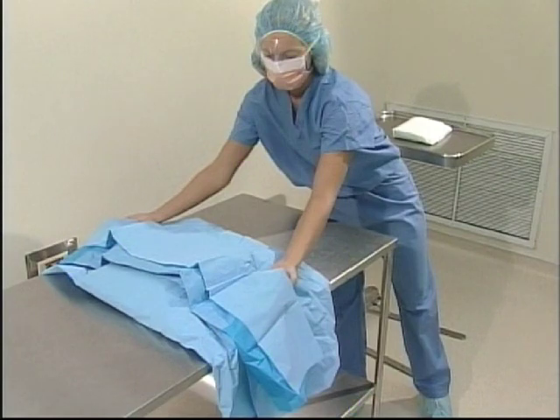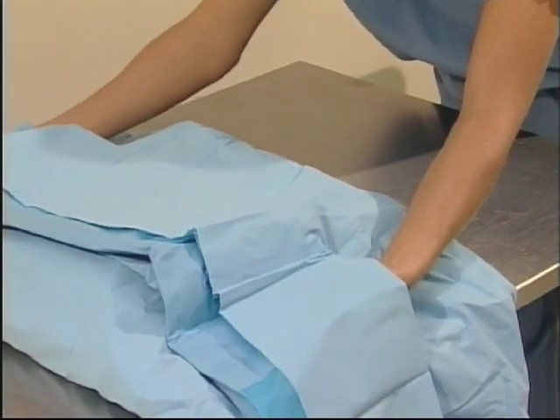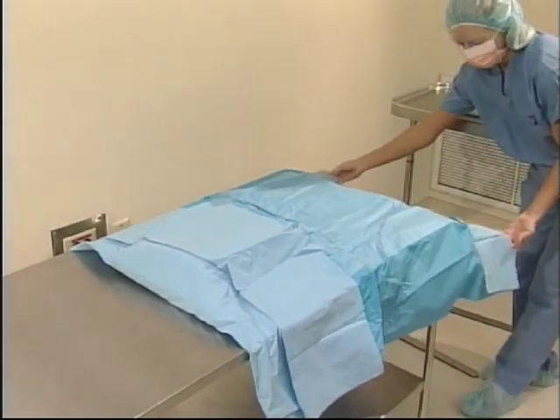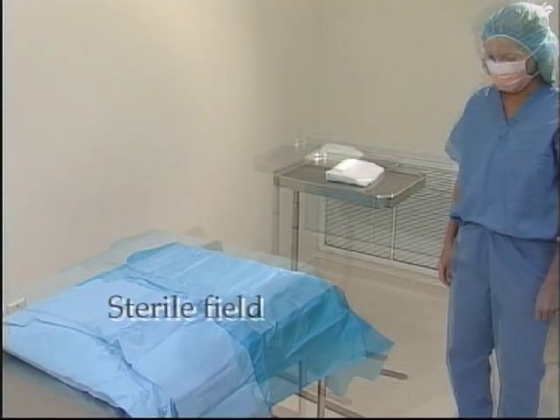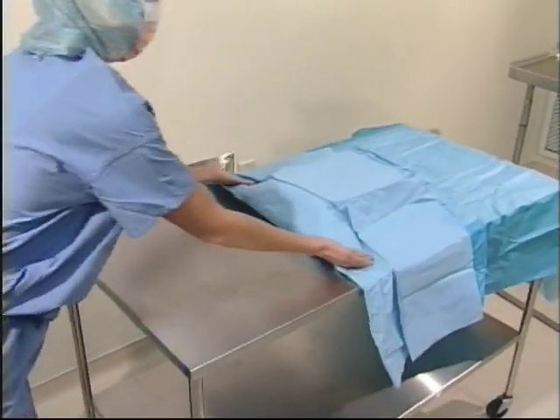Position yourself at the right side of the back table to open the third flap. Insert your hands under the cuff. Extend the drape to cover the table. Excess material is allowed to drop below the table level. Move to the left side of the table and open the final flap.